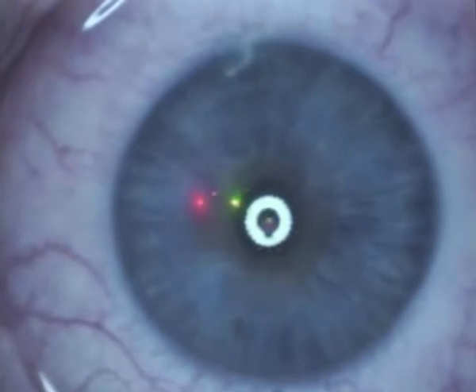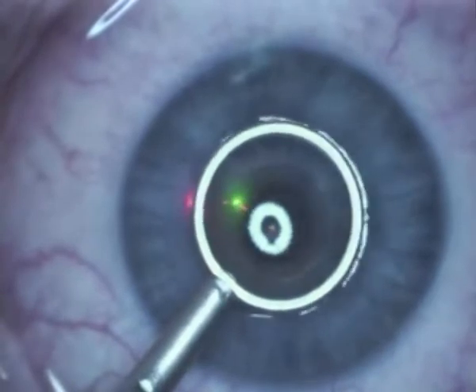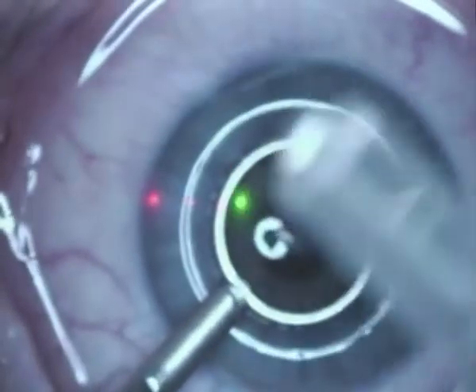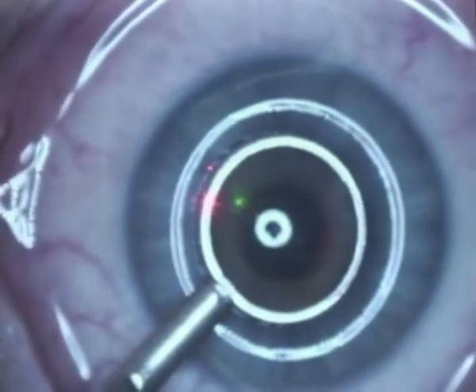So now we're going to take a corneal well, and the size of the well is determined by the size of the ablation and the optical transitions on the full ablation zone. We place the well on the visual axis and push down.